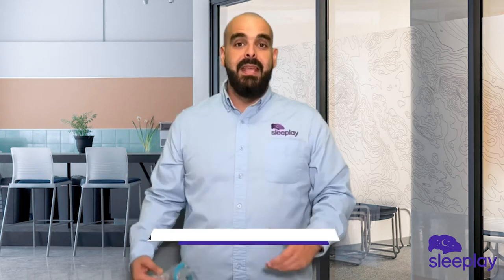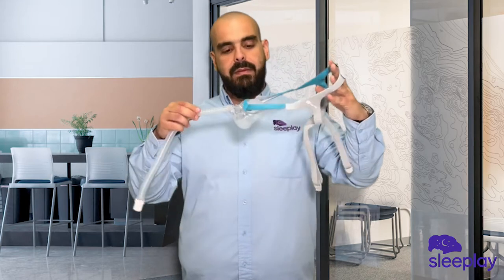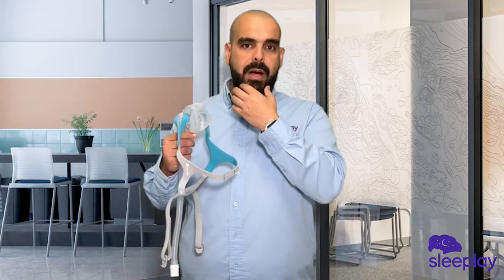The Fisher & Paykel Evora mask is the new full face mask from Fisher & Paykel. This is a cradle mask, so it sits right below your nose and covers your mouth.